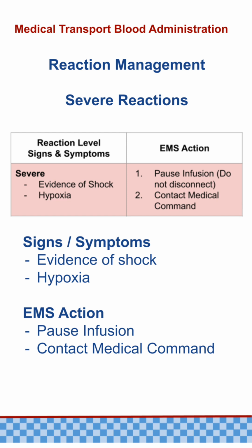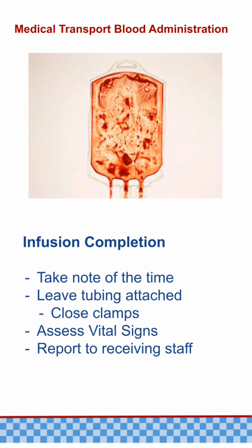Simply pause the infusion. Blood product administration typically takes about 30 minutes to infuse. Your patient's blood infusion may finish during transport to the receiving facility. If the blood product infusion finishes before you arrive at the receiving facility, take the following actions.